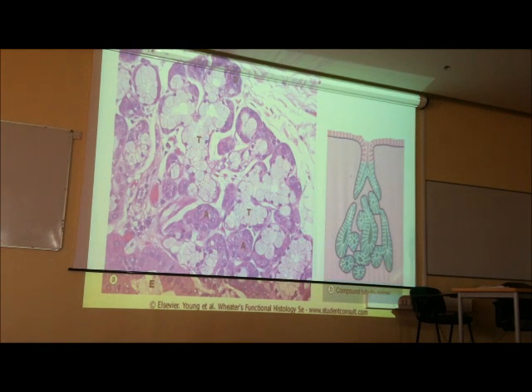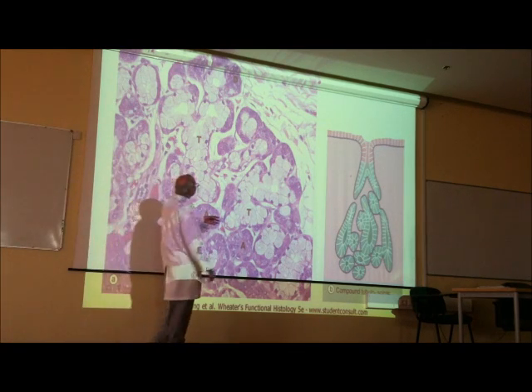What is about this picture on the left side? Mucus, serous, and mixed. Where are the mucus? The white areas.